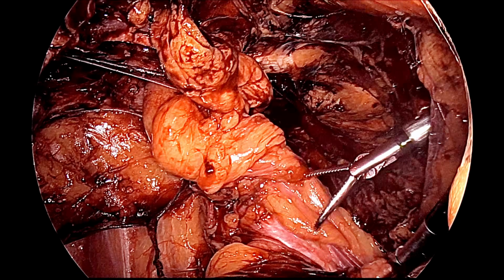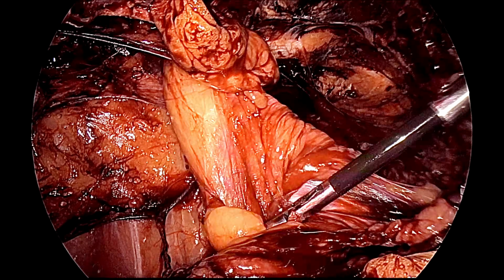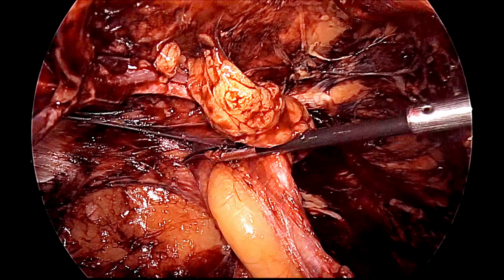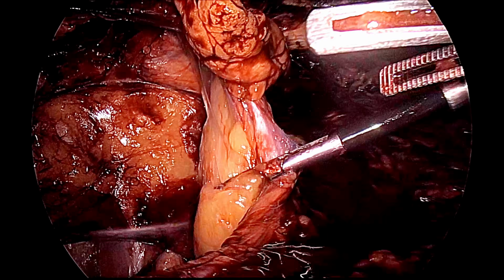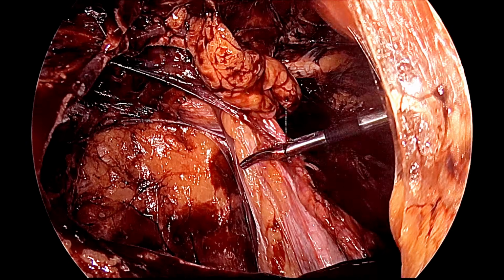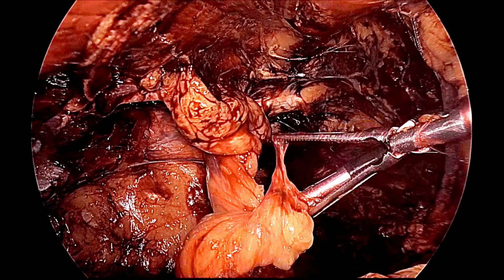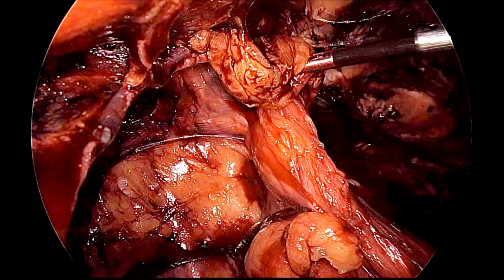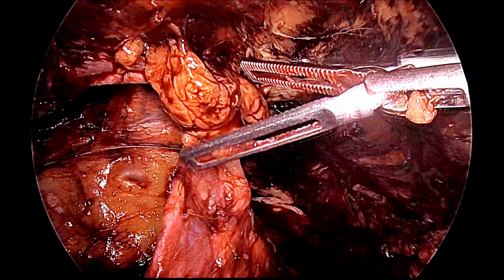But before that, we will try to find out the exact margin of the sac. And now this lipoma will be taken out. Gradually you can work over and you can pull this entire lipoma inside the abdomen and you can drop it towards the peritoneum. So, slowly this entire lipoma is reduced. So, it is down now.